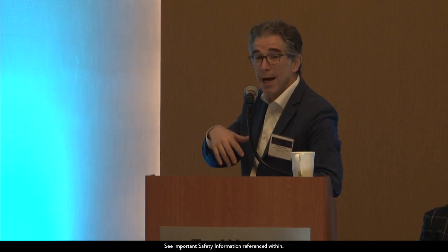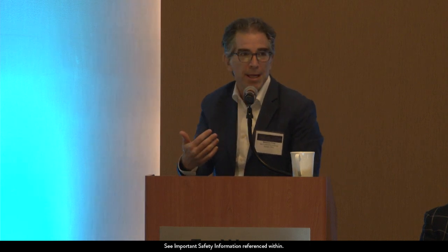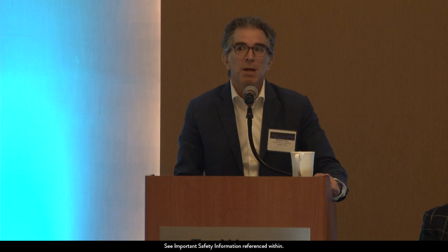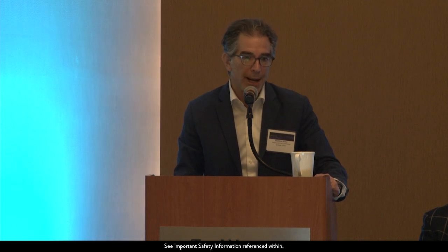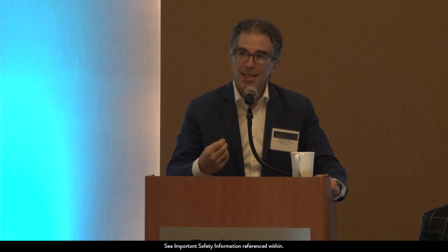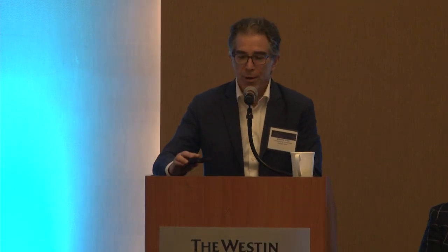I would tell you that if you're beginning your trek on CT, speak with your Abbott team, provide them the CTs, and they'll help you with analyses. So I think that doing the CT analysis should not be the rate-limiting step for you to adopt CT in your practice. And I think there is one anatomical limitation with deep pectinates, that CT may not pick those up, and you may find that your appendage is more shallow in reality than it actually is. So that's really the main thing. So with that, thank you for your attention.